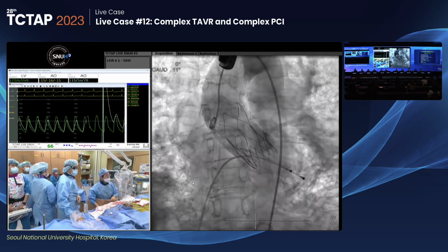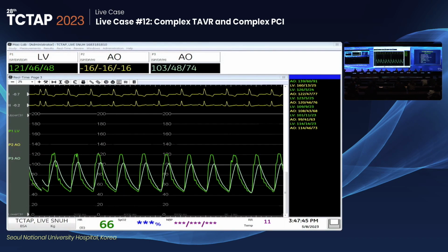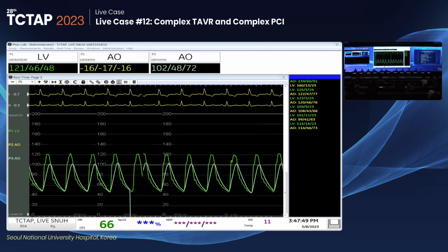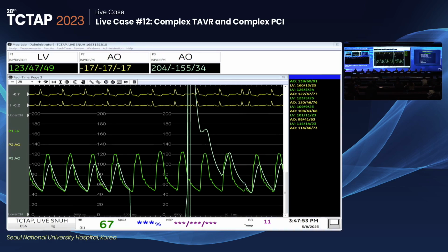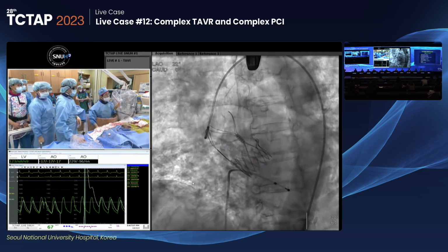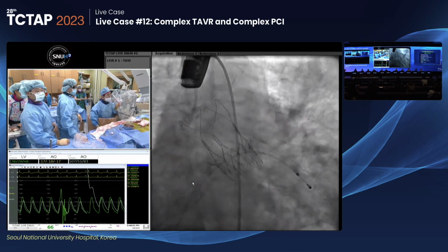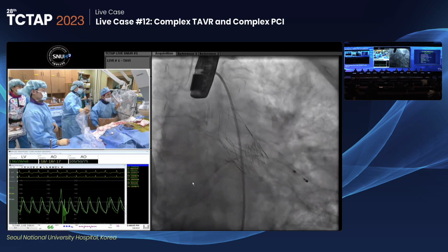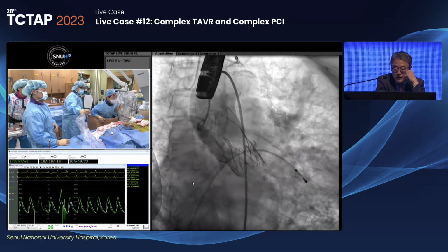No, I think it was real paravalvular, and I think it's better with the dilation. The contrast looks like it's coming from outside. Yeah, certainly on the left, doesn't it look like it's outside the frame? The pigtail doesn't generate that much. There's still a small leak, but it's better. Yes, it would be better to delineate the amount of the AR and to put in the multi-pigtail.